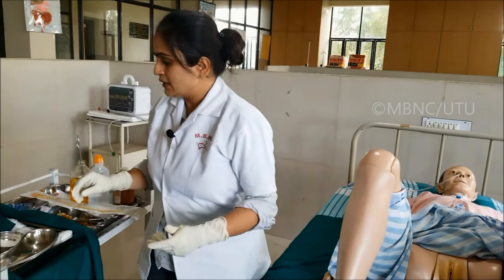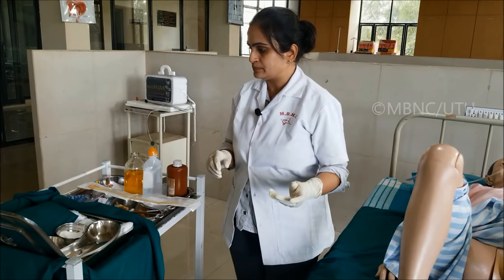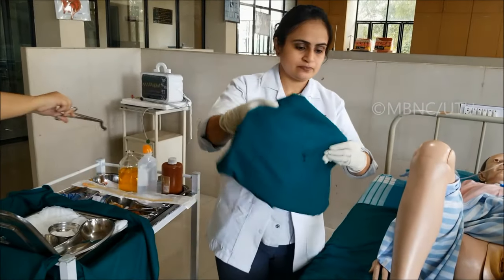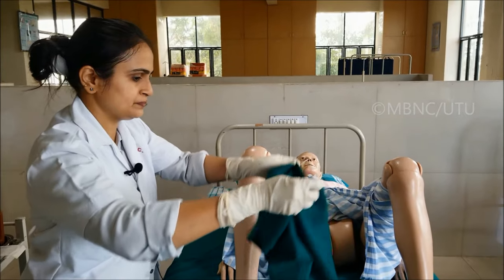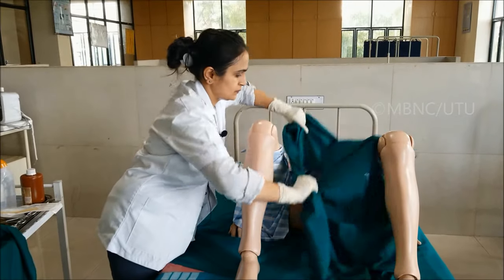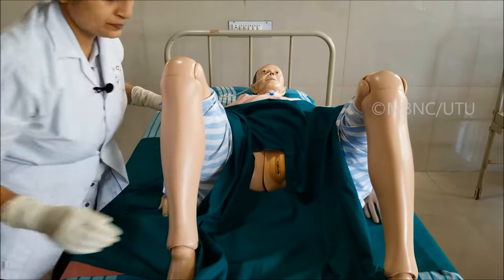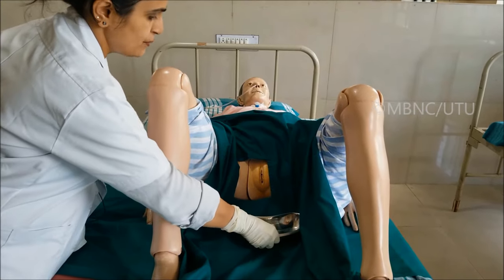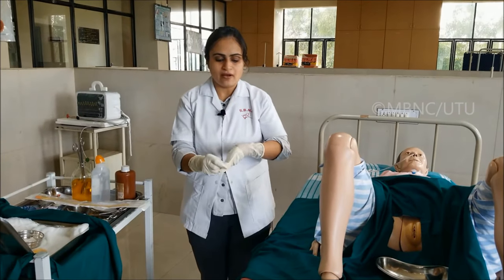After cleaning, with the help of an assistant, take the fenestrated towel and place it over the patient. Take a gauze piece, take the sterile kidney tray, and place it near the perineal area. After this, remove the extra pair of gloves.